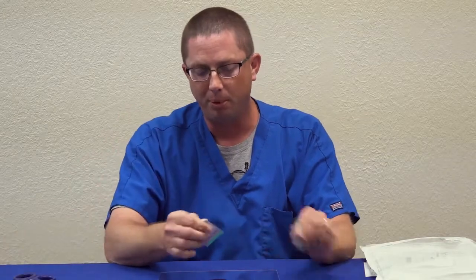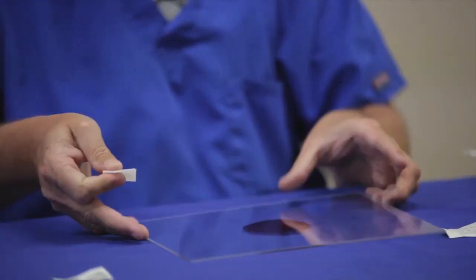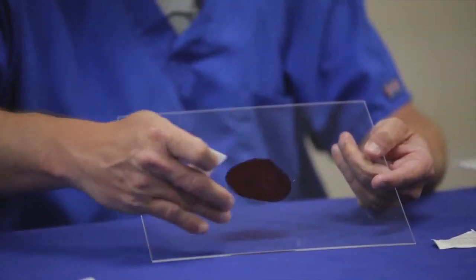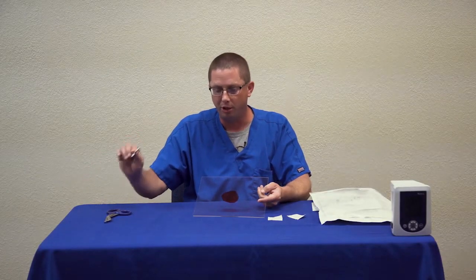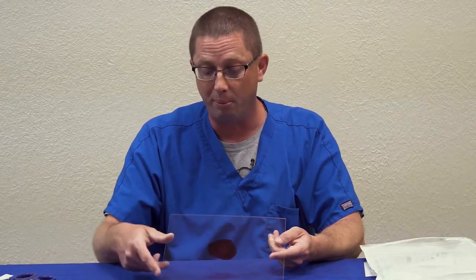From there, you want to assess the peri-wound area and apply skin prep around the peri-wound area. You want to ensure that you go about 1 to 2 inches out from the wound into the peri-wound area to ensure that you apply protection. The skin prep does 2 functions. It allows for the drape to adhere better and also protects the skin from any shearing that might occur or irritation from the drape being applied.